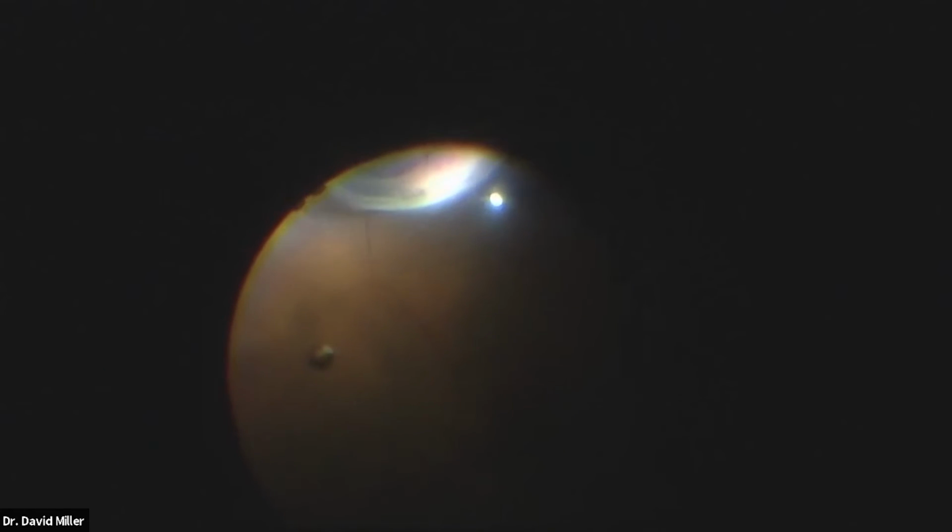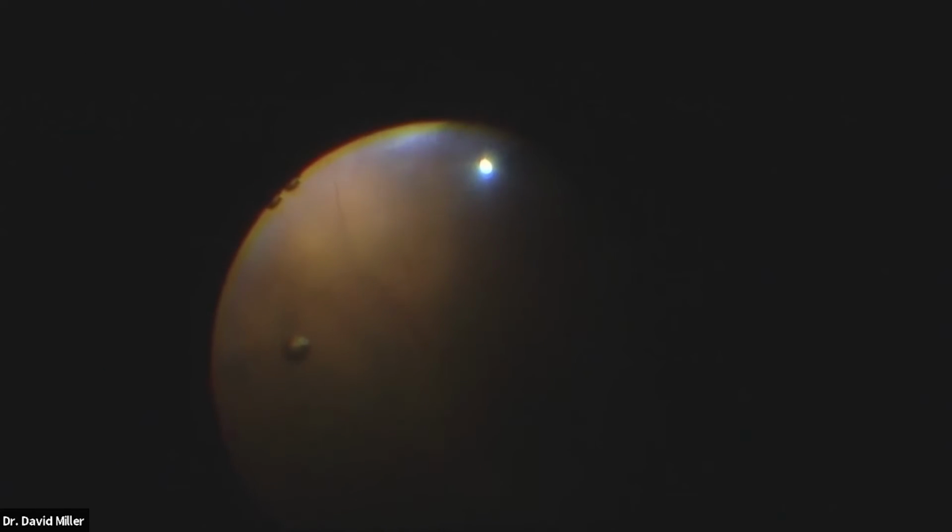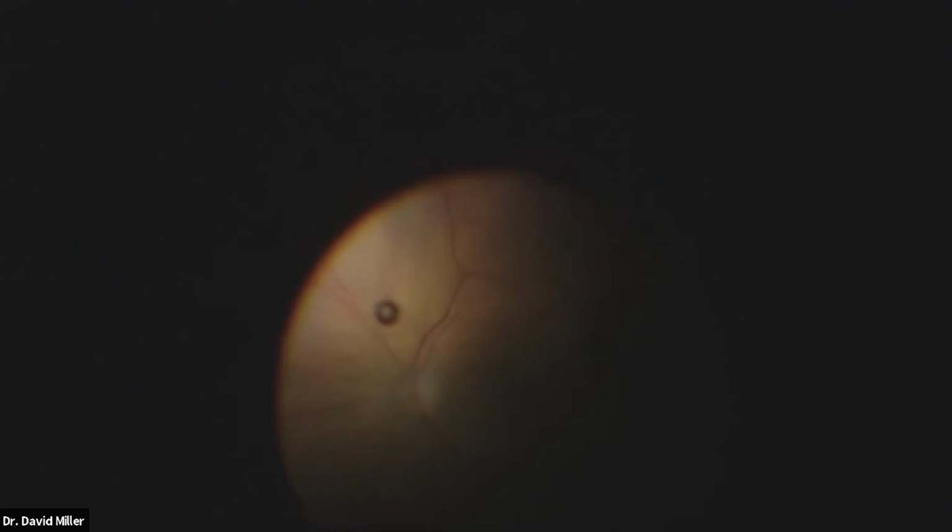Kenya, you're doing fine. We'll just go press that and take some of that pigmented vitreous out, Mike. How you doing? Do you have much pain? Okay. He's having a little discomfort. If he can work his way through it, we'll let it go. If it gets to be more discomforting to him, what we would do is supplement the block with a sub-Tenon's cut down. Let's go back to 6 o'clock.